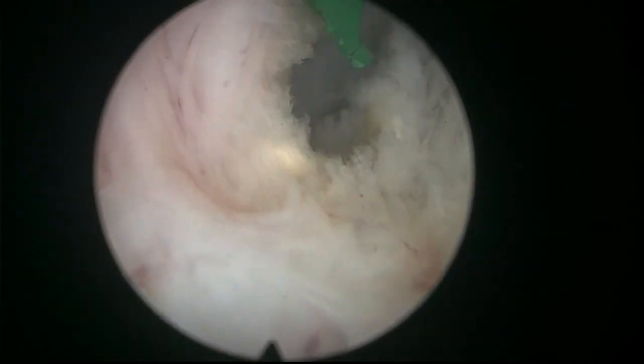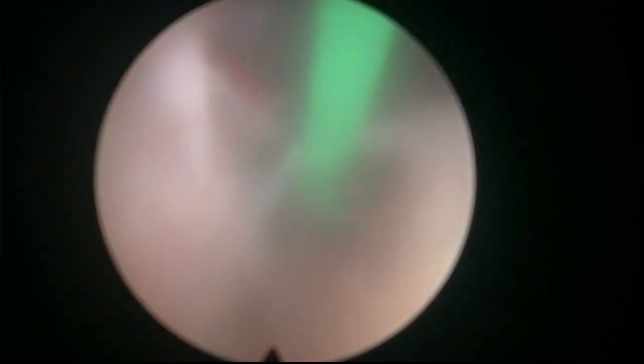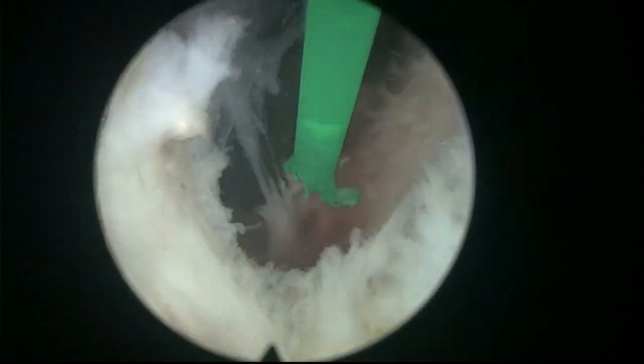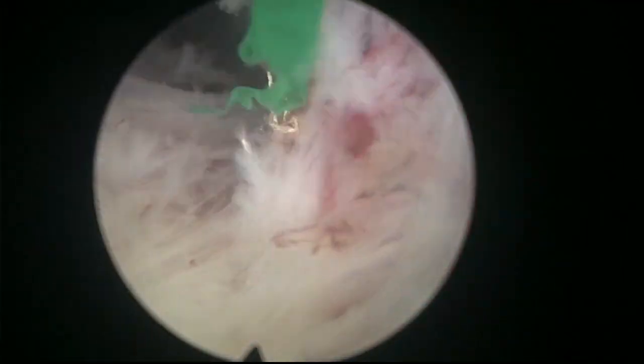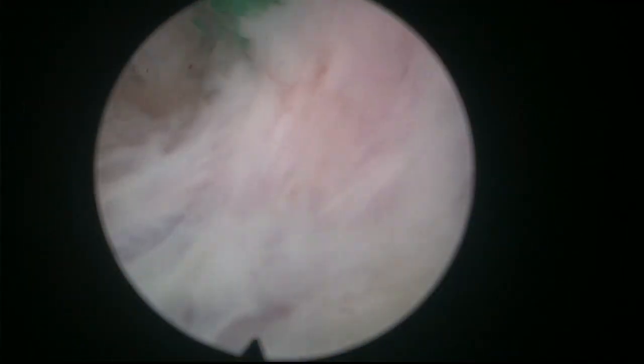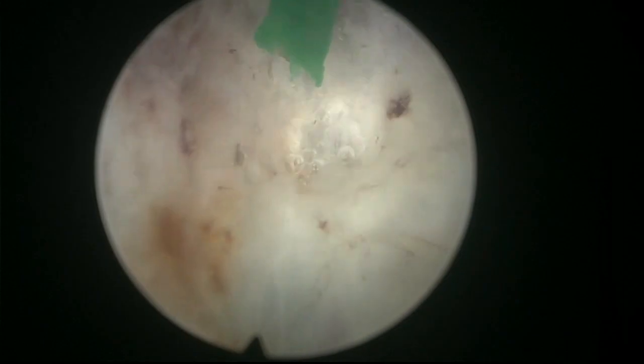So I think when you're going to enter the bladder, it's better to puncture early so the pressure is relieved and the flow of water can enter the bladder. And this will minimize the amount of mucosal dissection that's going to take place. There we are. And then the bleeding coming from the mucosa will be less as well. So we are progressing very nicely.